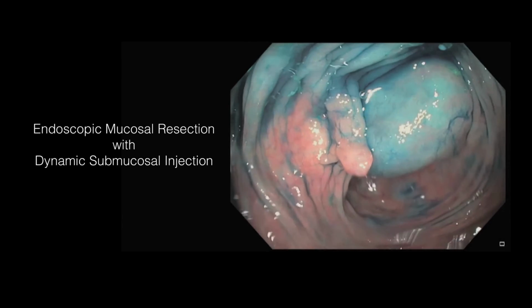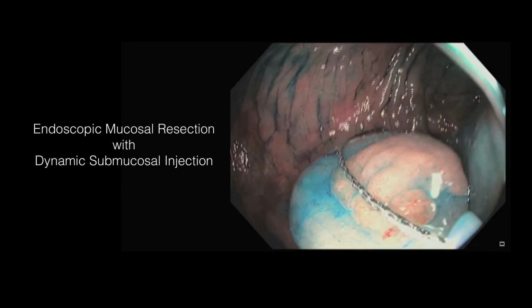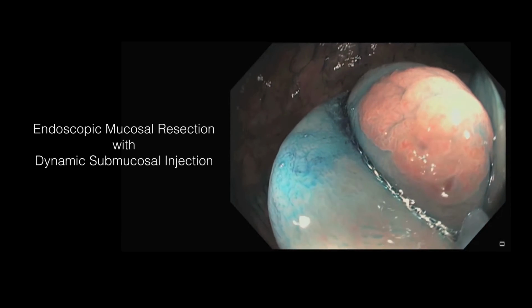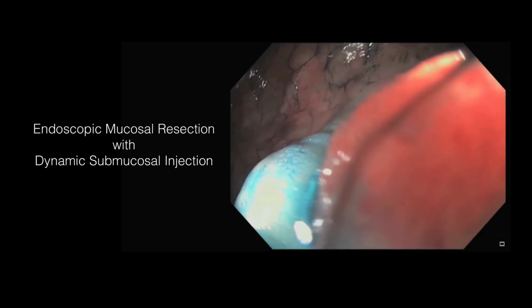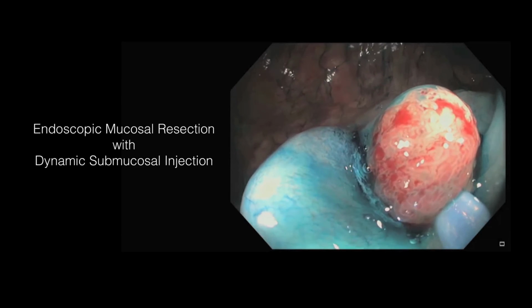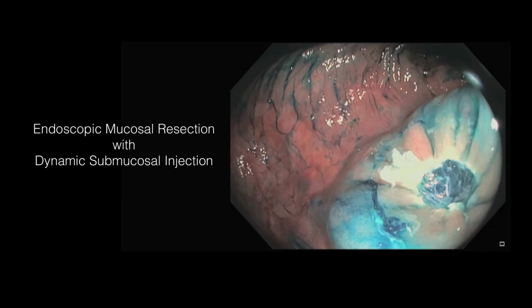We use slight upward tip deflection, suction the lumen, and nominally pull the needle catheter back, all while directing the injection into the lumen. In this case, the lesion lifted nicely to form a large bleb. We perform EMR, placing a snare at the normal surrounding edges for en bloc resection. In non-lifting cases due to underlying fibrosis, endoscopic submucosal dissection may be necessary for complete resection.